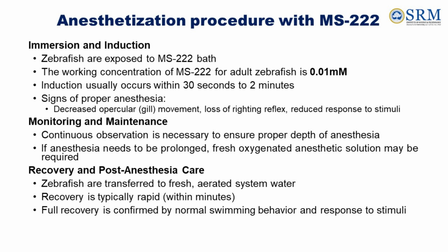Now let us look at the parameters for monitoring and maintenance. We need to continuously observe the experimental fish to ensure proper depth of anesthesia. If anesthesia needs to be prolonged, fresh oxygenated anesthetic solution might be required.